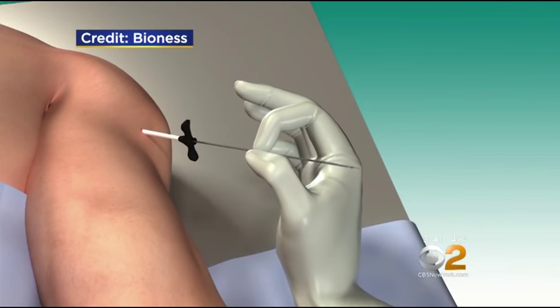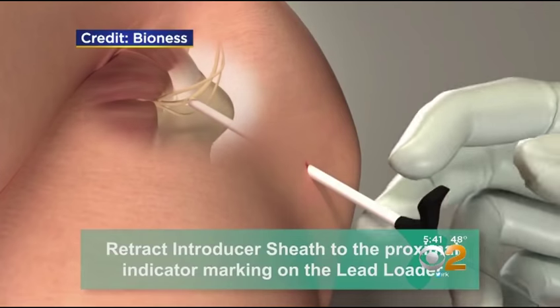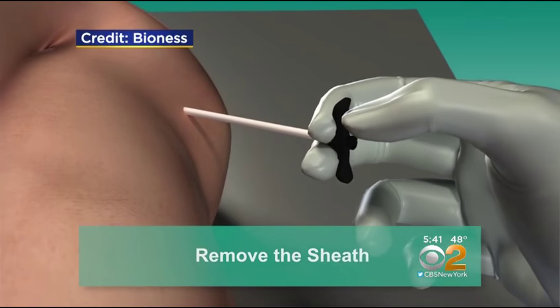Pain often comes from hyperexcitable nerve fibers that are easy to fire. So by taking that away and making the nerve fire more normally, we're able to block a lot of the pain. Unlike other electrical pain blockers, this device isn't inserted into the spinal column. It's placed directly on a peripheral nerve in a 15-minute procedure under local anesthesia.